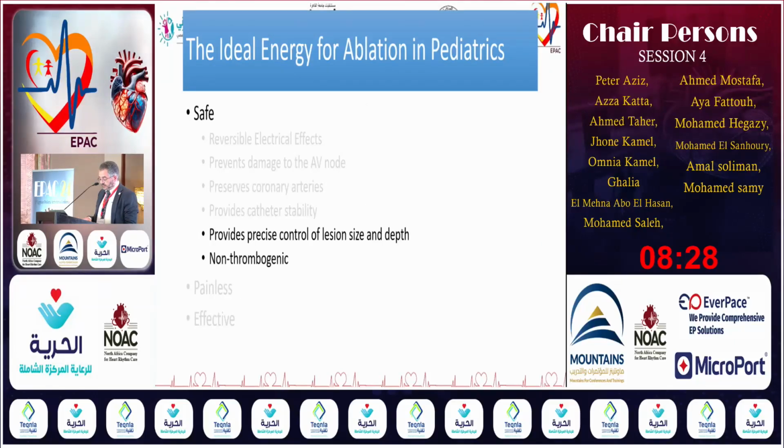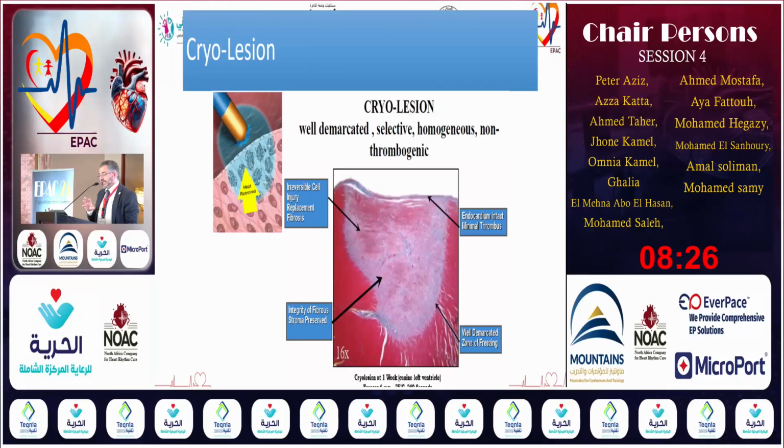And again, you can control exactly the lesion depth by controlling the catheter tip. So it is not titratable as the RF. I cannot push the power high up to create a larger lesion. If I want a larger lesion, I have to choose a larger tip catheter from the beginning. But I cannot titrate the temperature. It's all or none once I use the catheter.